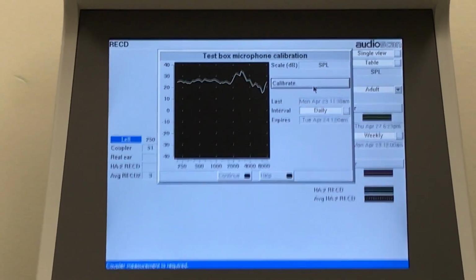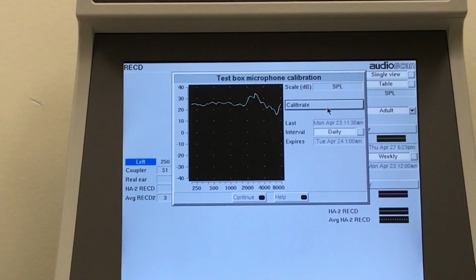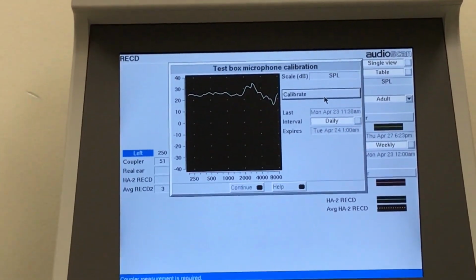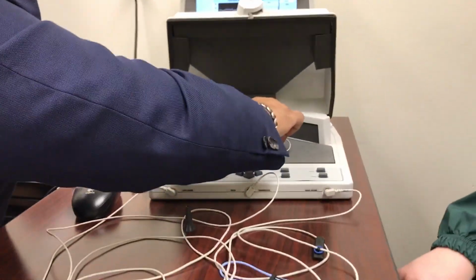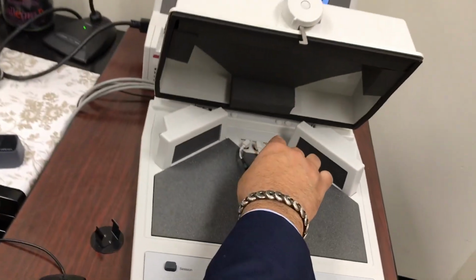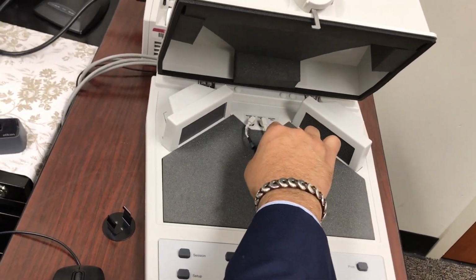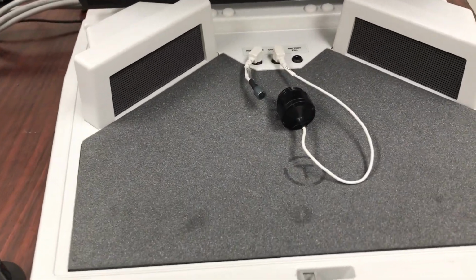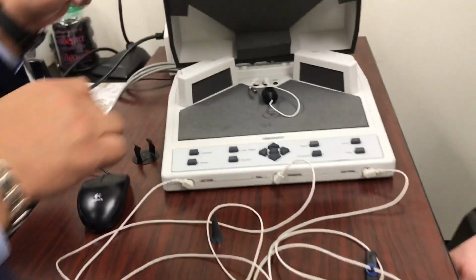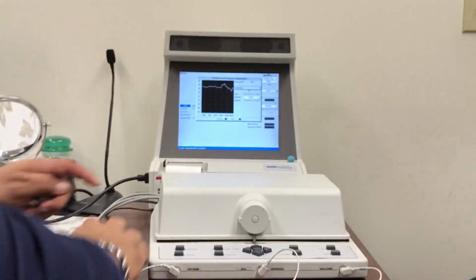I have a lot of noise in here. Oh, that's my fault. That's Teleco. Sorry. It's got to go in this little square. Okay. Don't do what I just did. Don't do the T. The T is Teleco. Let's try this again.